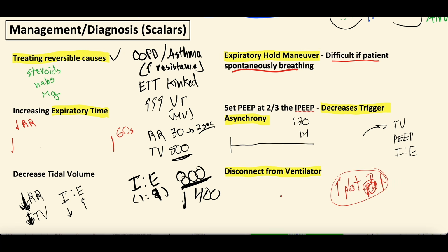So when you disconnect a patient from the ventilator, push on their chest, let them breathe all that AutoPEEP, all that stacked breath out, hook them back onto the ventilator. You'll see that plateau pressure go back to normal, their blood pressure get better, and all that good stuff.